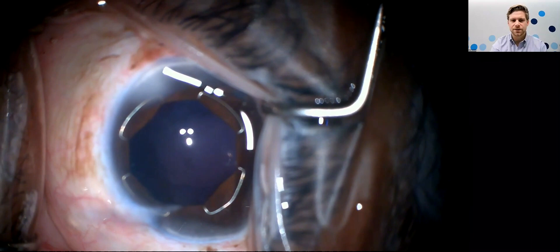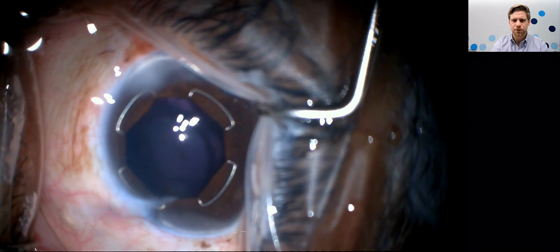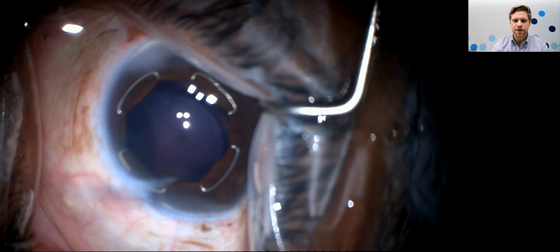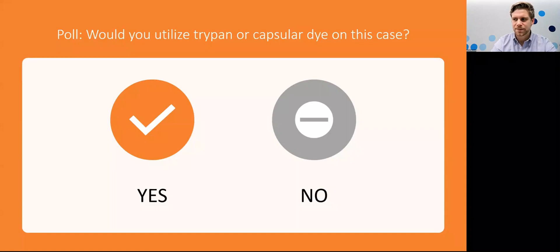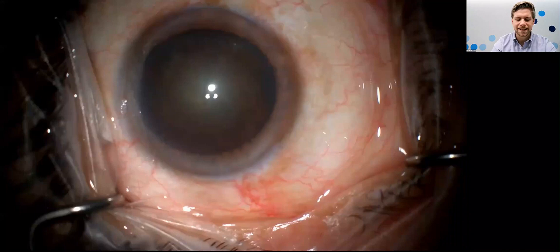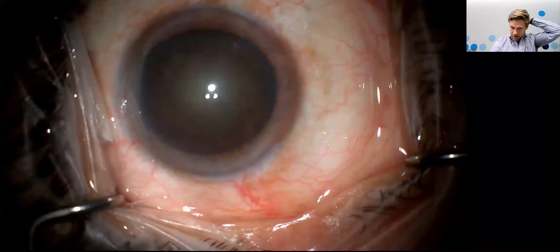I'm increasingly using Zepto or precision pulse capsulotomy. One caution about trypan blue in patients with zonulopathy: it can turn the entire eye what looks to be black and you can completely lose your red reflex. Here I'm putting in a CTR — I did not know preoperatively that this patient had zonulopathy. If you know there's a zonulopathy, take your time with trypan blue or consider another method of capsulotomy. The iris speculum shown is the X1 from Biomatrix — made of a nitinol ring, very gentle on the iris, preferred in shorter eyes due to its slim profile. I have a question for you: would you utilize trypan or capsular dye on this relatively dense lens case?